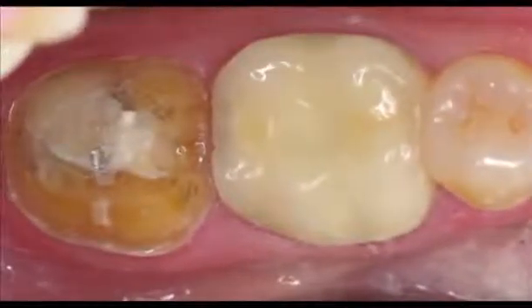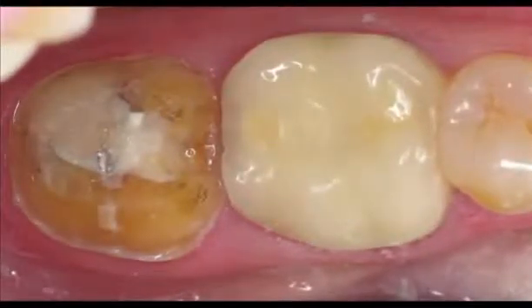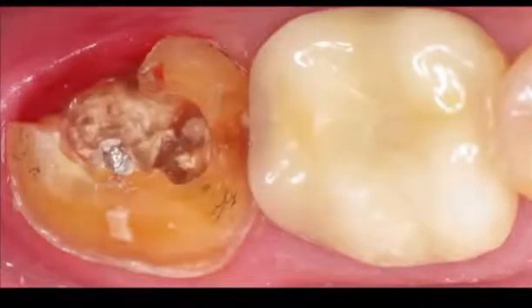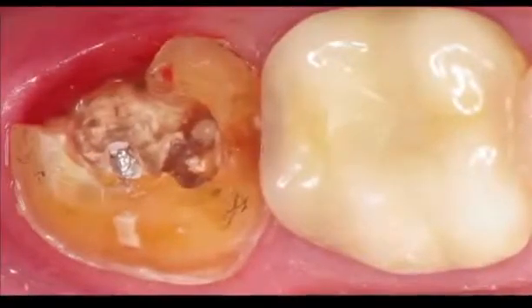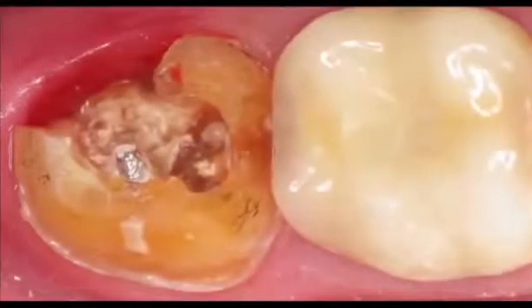As I was cutting into the buildup on the mesial, the distal lingual of the filling just fell right out. There was no adhesion at all to it. In fact, the gold crown was probably keeping it in. Now, at this point in the game, I'm instantly thinking, oh goodness, this is going to be a much more difficult case. And what do we do?